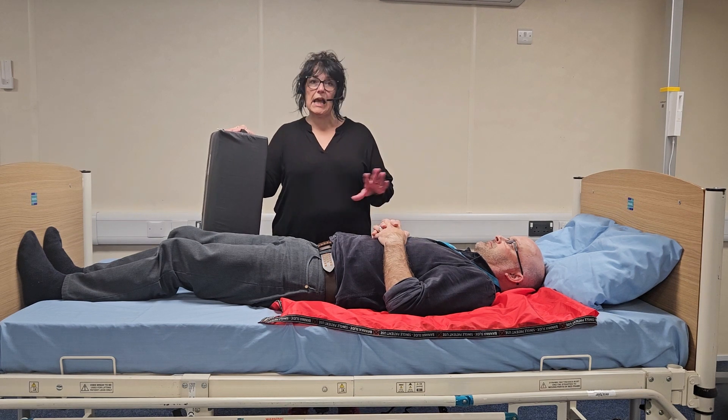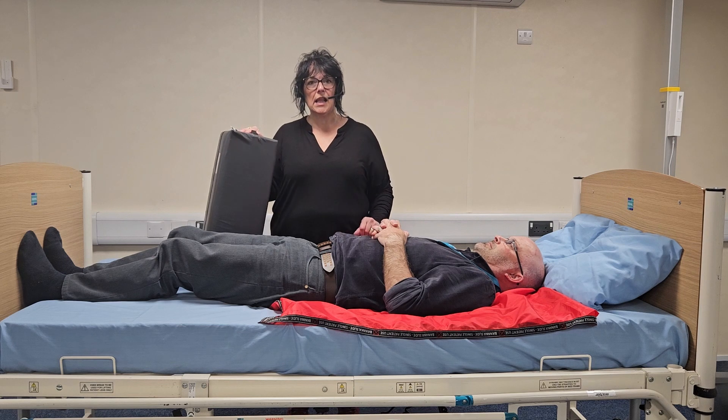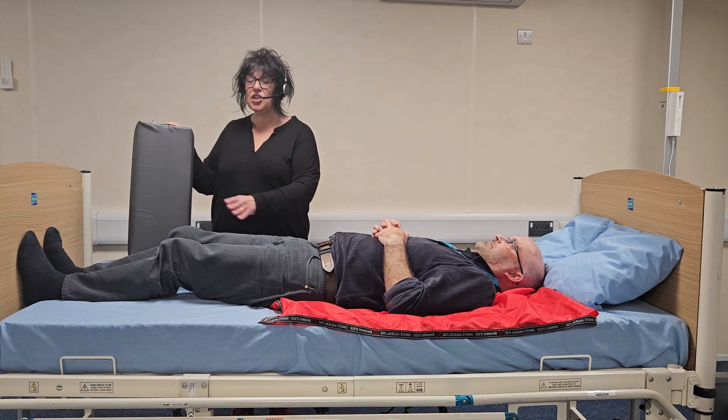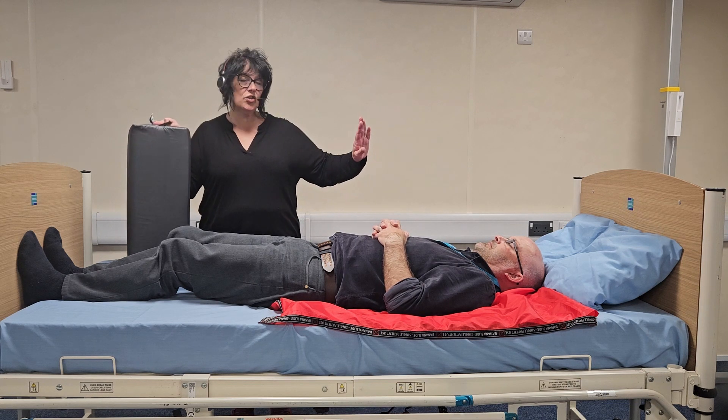This is an active slide up the bed using a positioning wedge and slide sheets. As you can see, the person is positioned too far down the bed and we need to move him up into a better position.